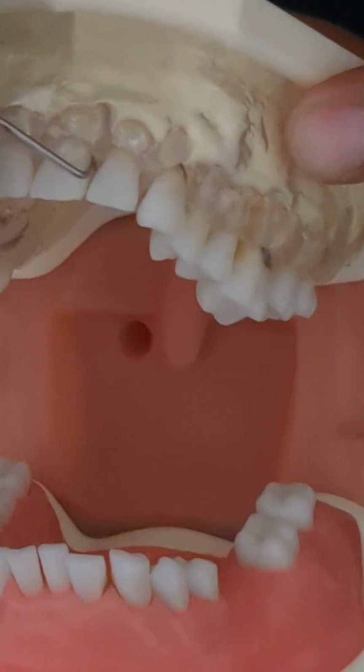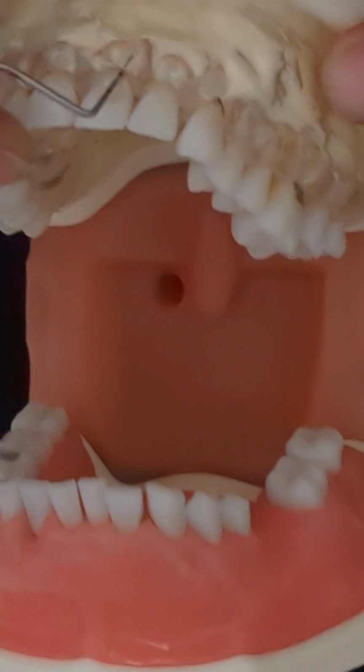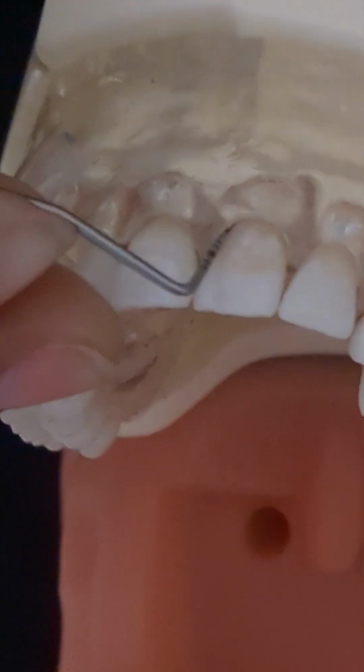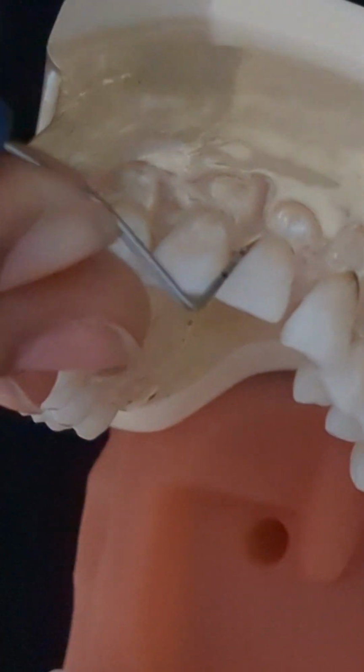We have an 8, 7, 8. Now turn his head just a little. We have a 10. Seems to be a 7. Followed by an 11. Turn his head slightly again.